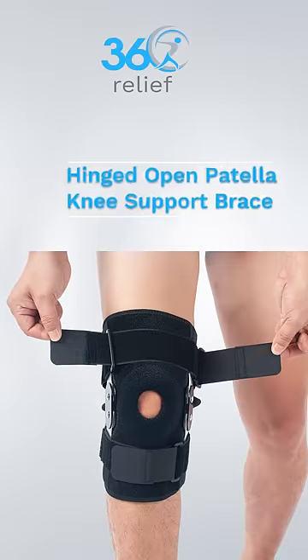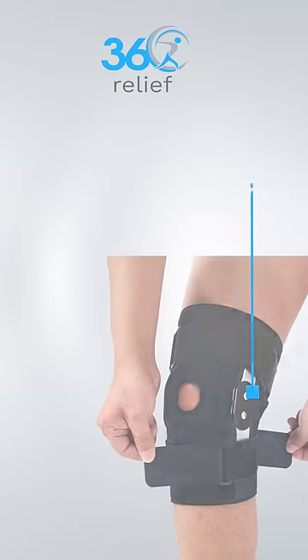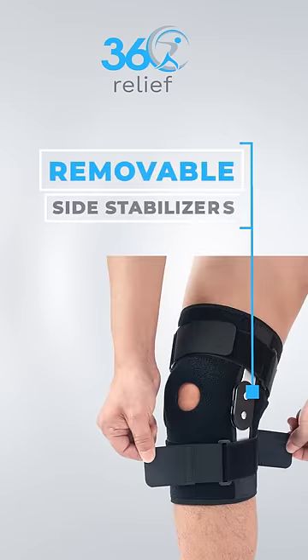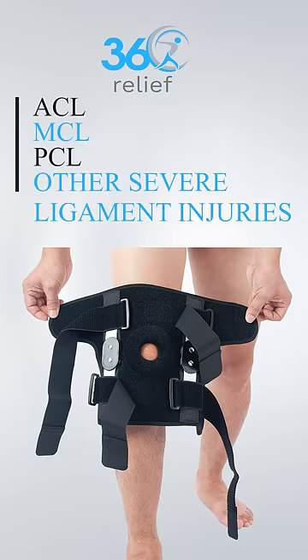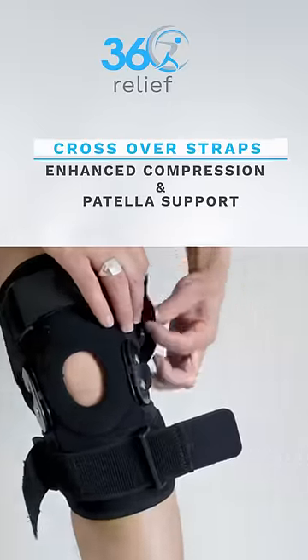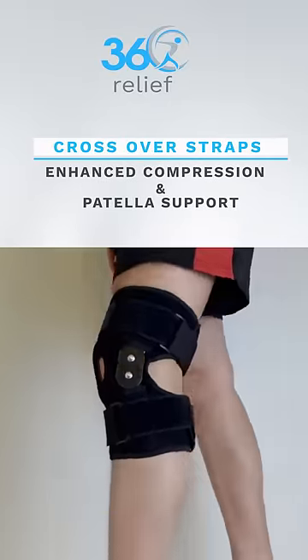360 Relief hinged open patella knee support brace with removable side stabilizers, designed with hinged metals on both sides of the brace to support ACL, MCL, PCL, and other severe ligament injuries. Crossover straps of our knee brace provides enhanced compression and patella support for our knee.